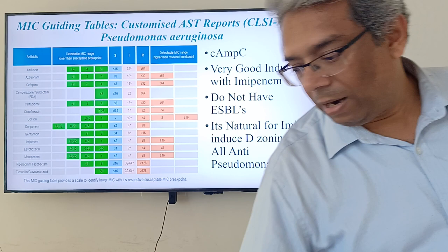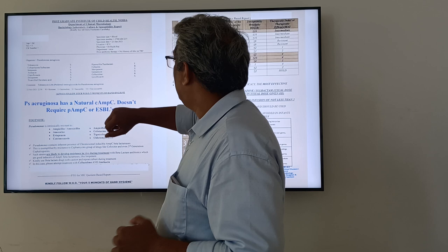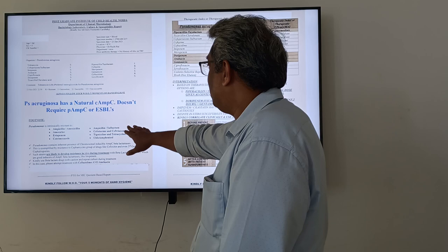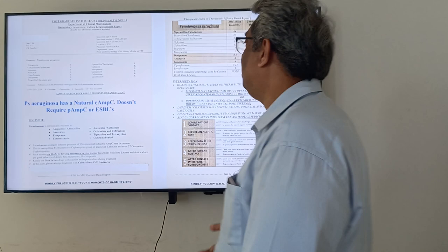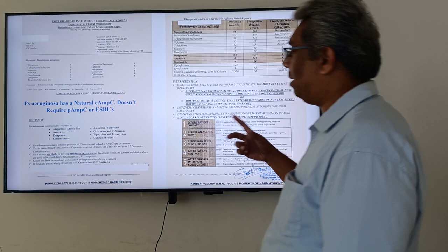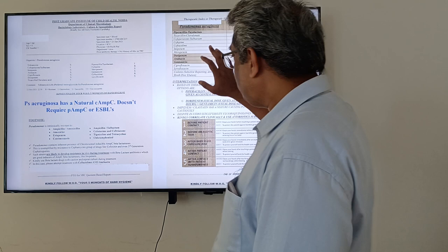Now, this is again a report from my previous institute. This is a blood isolate from the neonatal ICU, growing Pseudomonas aeruginosa. We have put up these footnotes: it is intrinsically resistant to ampicillin, amoxicillin, amoxiclav, cotrimoxazole, chloramphenicol, tetracycline, cefotaxime, ceftriaxone. It is a naturally AmpC producing isolate, so it is likely to develop resistance in vivo during treatment. So you can attempt treatment in this case with ceftazidime and amikacin, and ceftazidime has to be given as an extended infusion. Depending on the therapeutic index, we can give that drug accordingly. So in this case also we can go in for ceftazidime.